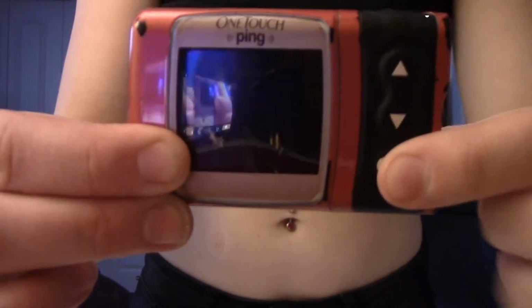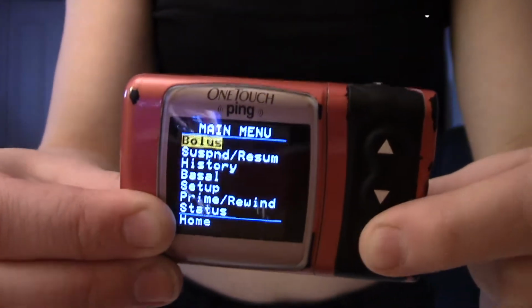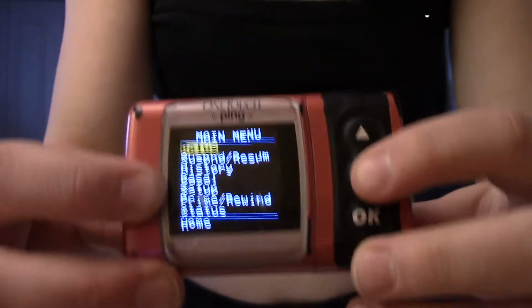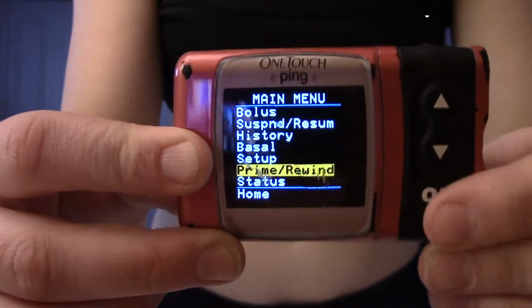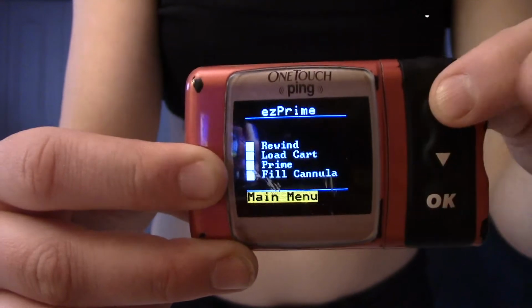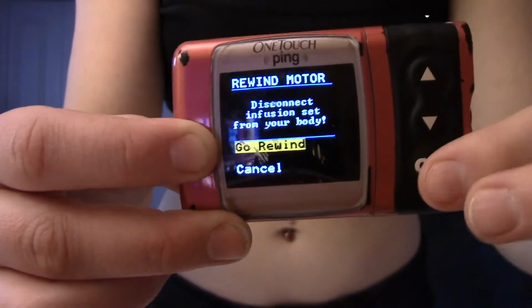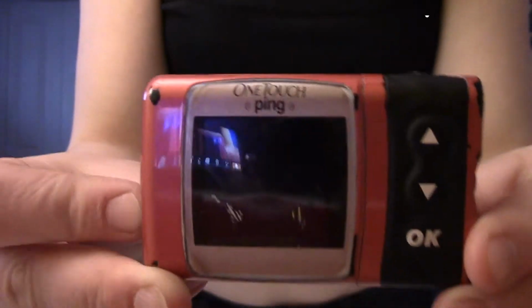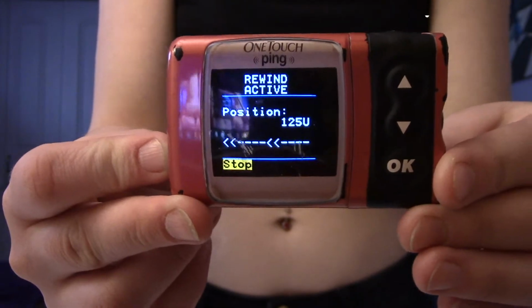Alright, next thing we're going to do is we're going to rewind our pump. So, for my One-Touch Animas Ping, all I have to do is I press the OK button, the menu button, and then I'm going to go down to Prime Rewind. And I'm going to go up to Rewind. Press OK. Go Rewind. Press OK one more time. And it's going to rewind it back so I can put my new cartridge in next. So this will take a couple of seconds.